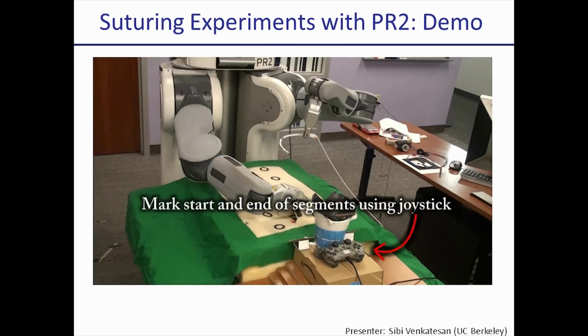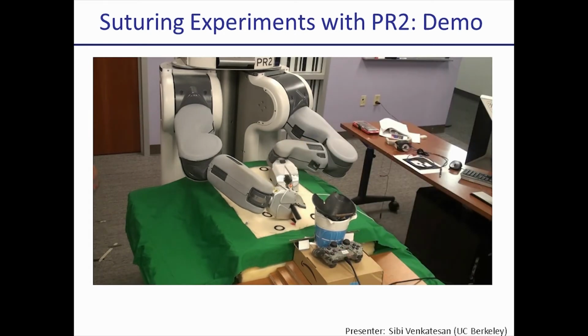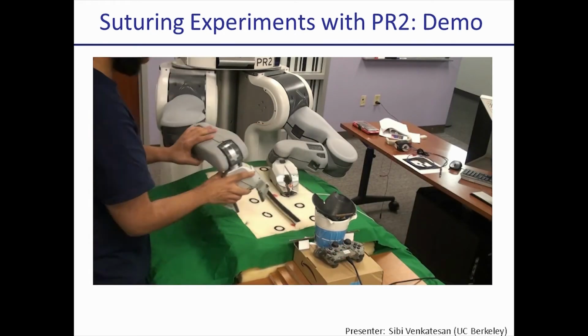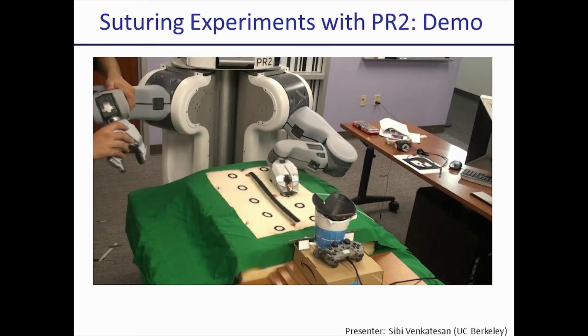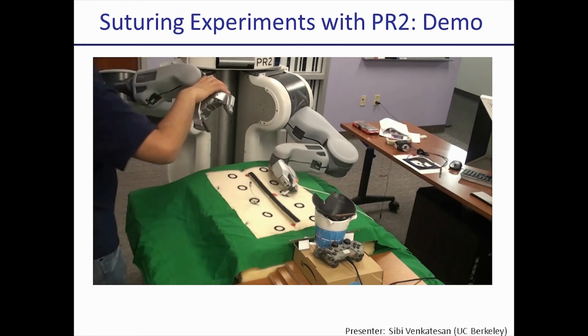The task here consists of piercing the first flap, followed by piercing the second flap from the inside, and then removing the needle.